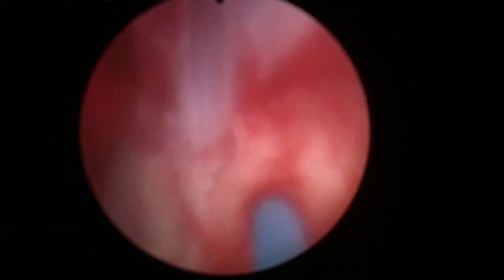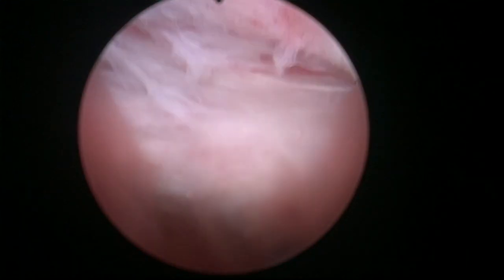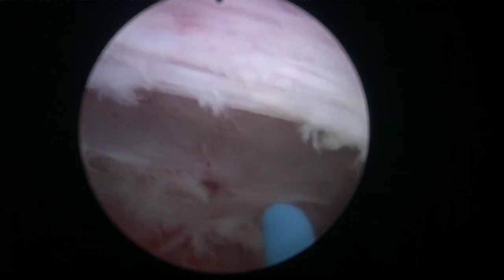Let's lift the other side as well. See, what I achieved is to push the adenoma into the bladder. Look how the visibility falls inside the fossa. You see much worse. Look at the adenoma, it was going retrotrigonal.